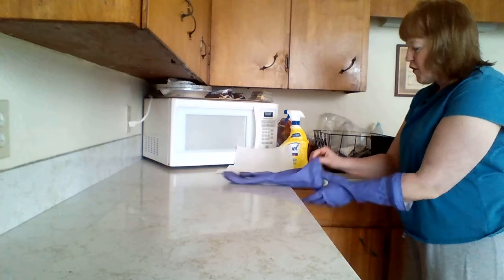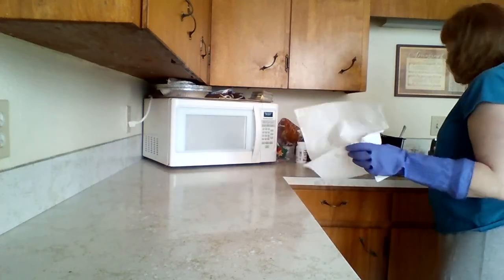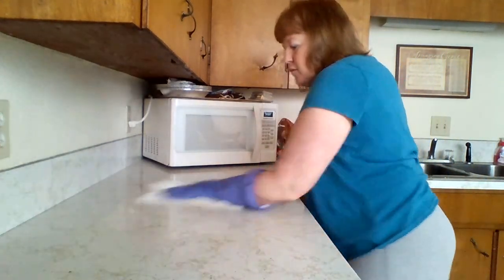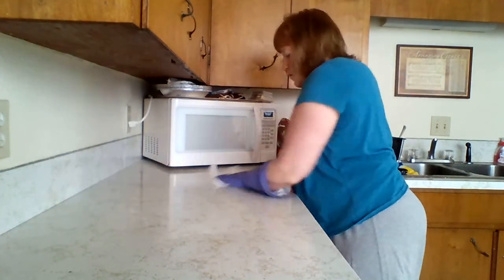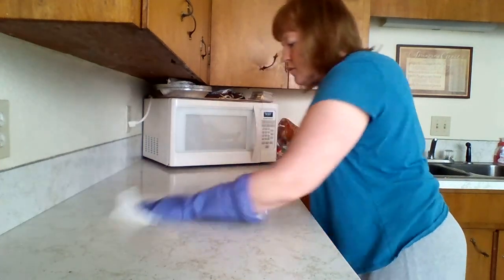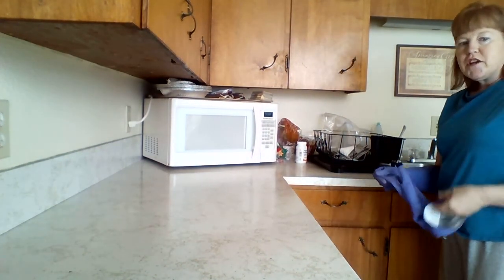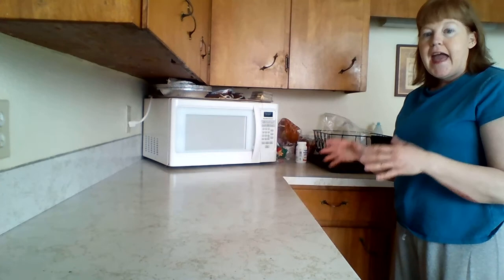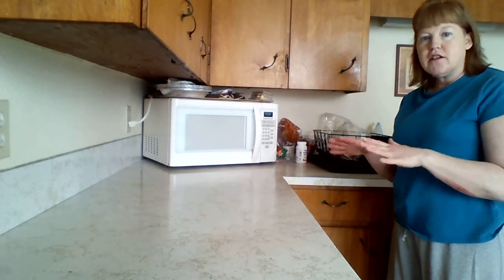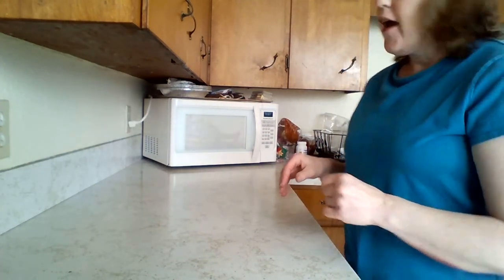Don utility gloves for cleaning the Mayo stand surface. Dispose of the towel in a regular trash can. I'm going to remove the utility gloves, and at this point I would wash my hands and don sterile gloves, or don other gloves. Okay.